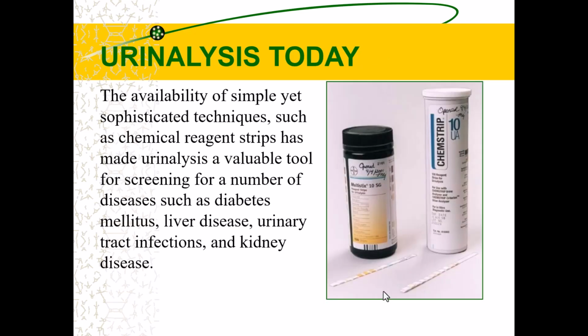So today, we get these great strips. These are multi-stick chem strips, both kinds of strips we have in the lab. They're very simple, they're inexpensive, yet they're pretty sophisticated because you can tell a lot of information from a simple dipstick. If you think back to basic lab skills, you guys all did dipsticks, right? Some of you might have just done ketones and glucose, some might have done a whole dip. It kind of depends on where you took the class, what strips we had available. We use this still today.